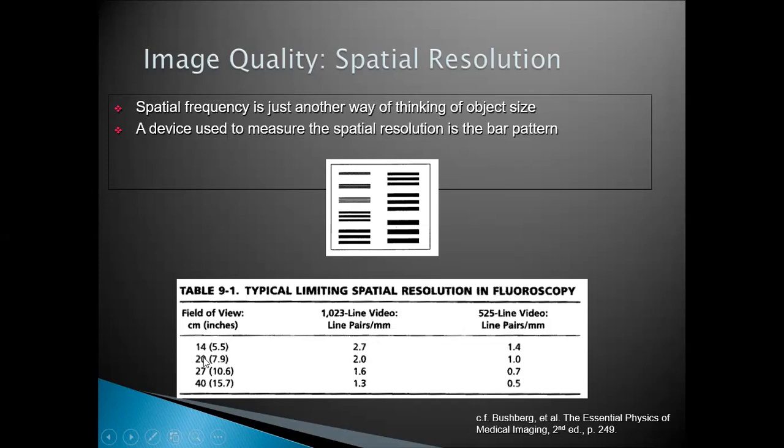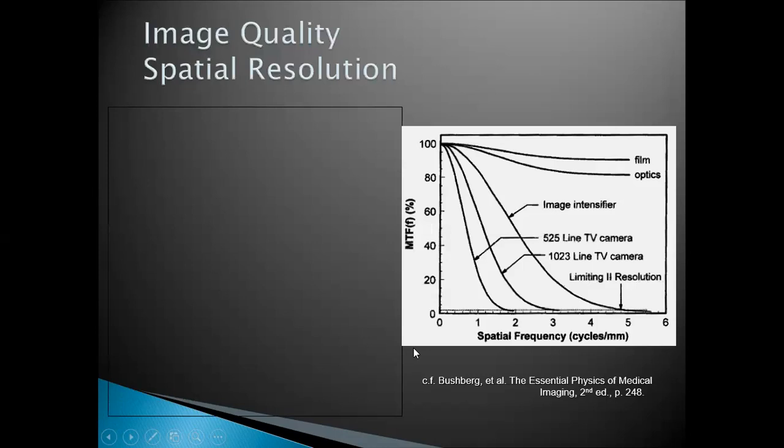You can see that for 20, it doesn't require as much resolution as the one of 14. So as the image intensifier becomes bigger, not so much emphasis is placed on the spatial resolution. I think we'll get to this. Okay, let's look at this diagram.